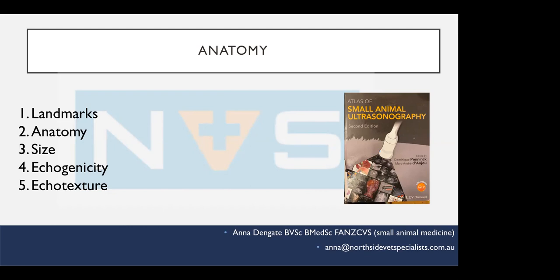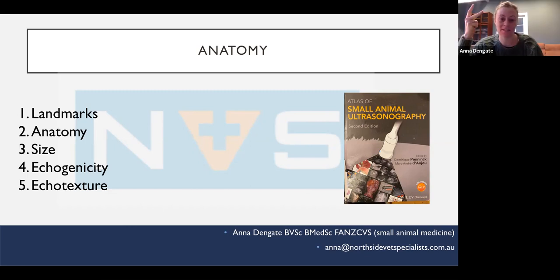Spleen. Excellent, good. Sometimes we can see them together and that's really nice because then we can compare echogenicity. Sometimes they don't quite extend, and there's a lot of breed variation in the position of the liver, but also a lot of variation in the size of the liver within dogs, and whatever the diseases might be as well. What about on the right-hand side of the body?